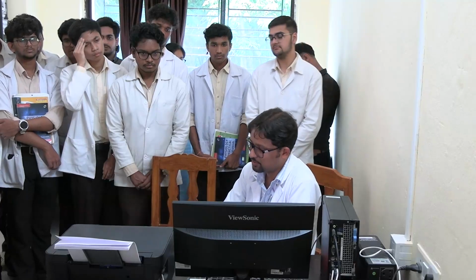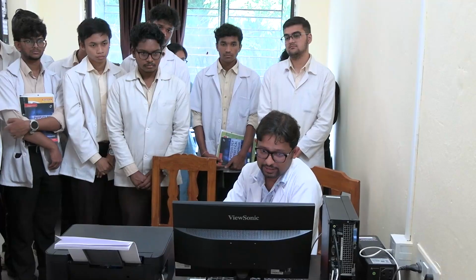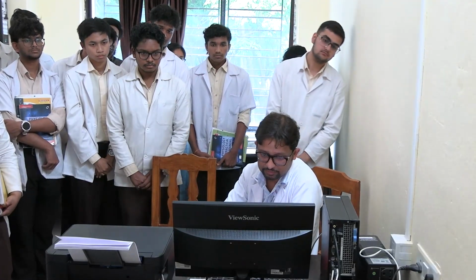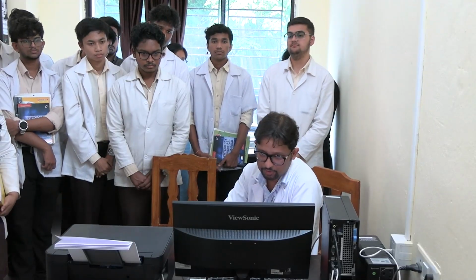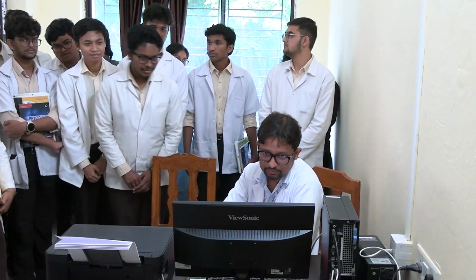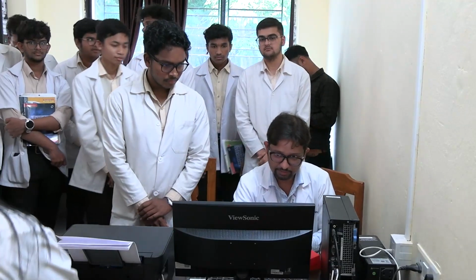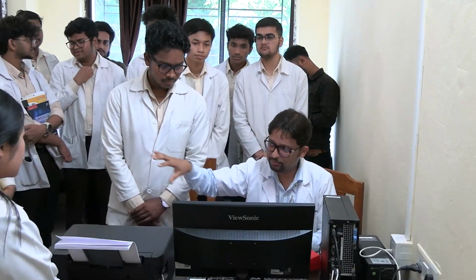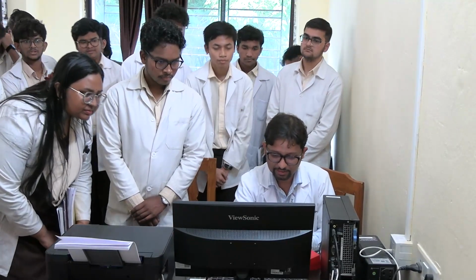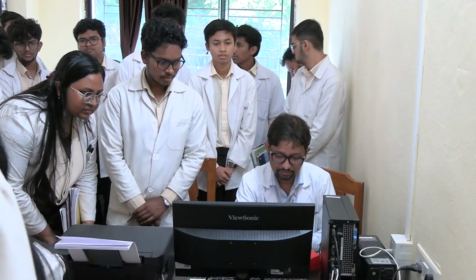Whenever we are recording the spirometer, for a fresh subject or a fresh patient, this information needs to be entered, right? So first we will enter, we're going to be the first subject. So first we'll give an ID. This we'll name TSMC. You can come this side. One at a time we'll see. That's why we've chosen 5 subjects. So those you see now, they will make space for the remaining. So 2026. This is our ID. Your name? Sajid. RSCH ID.